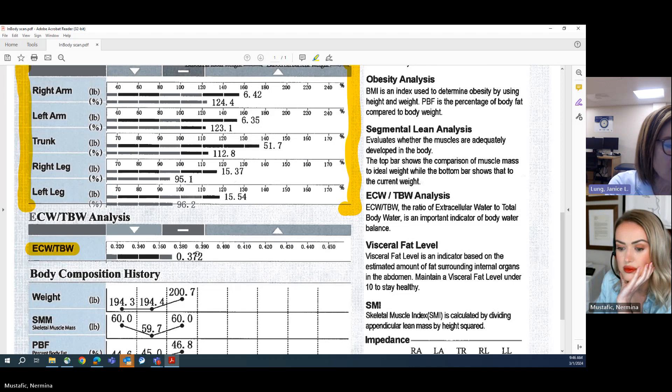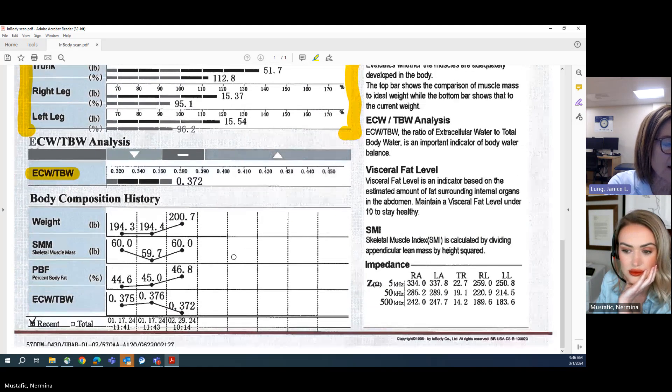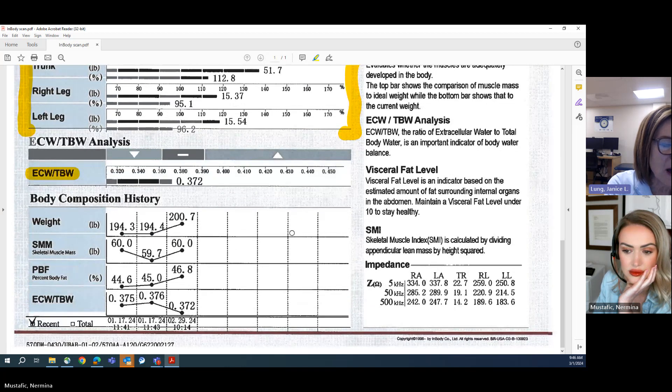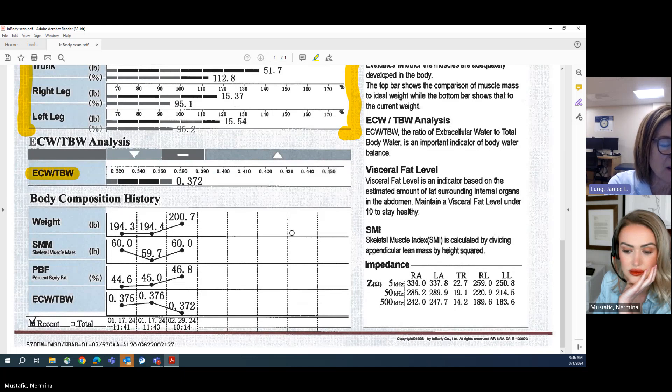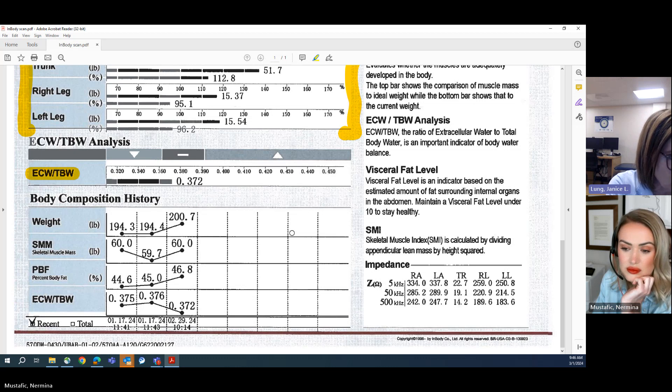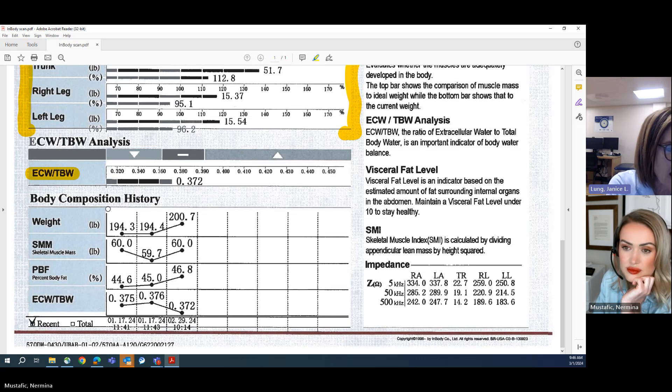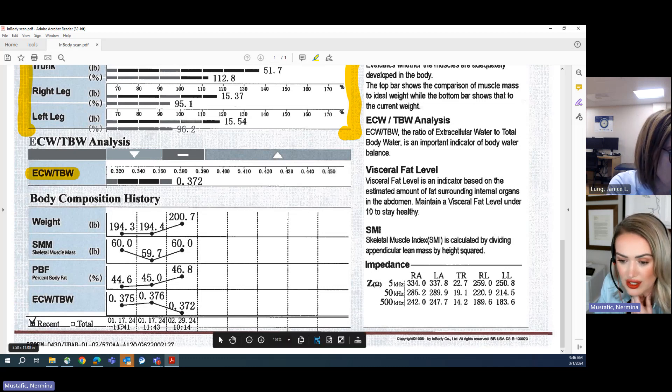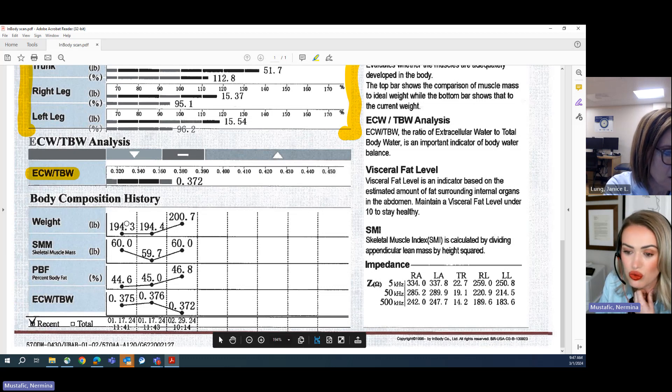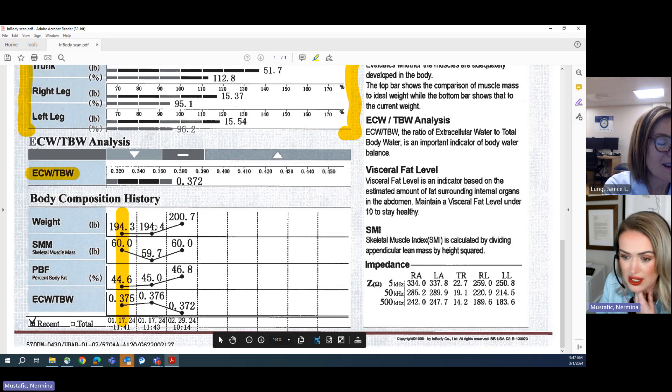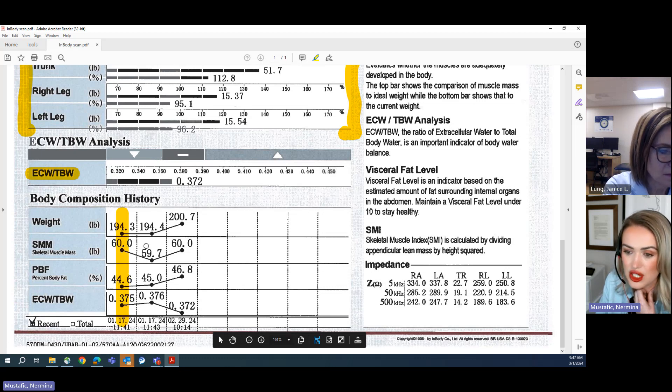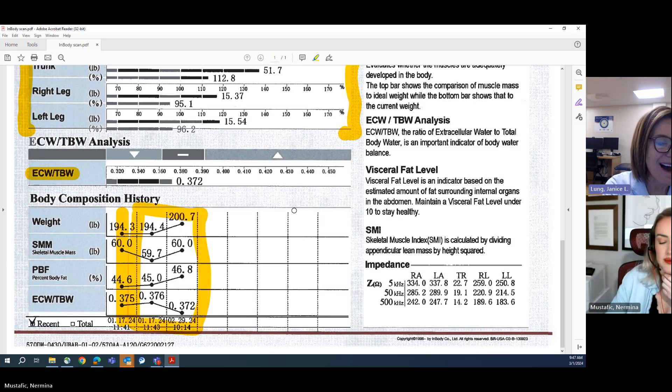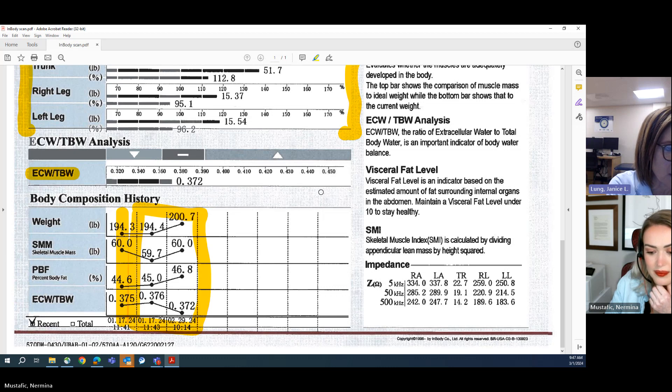If we go down to this body composition history, right away we can see that this particular person, she's done the InBody three times because she has three points here of interest. What we can see from this is that over time, ever since she took her first InBody January 17th of 2024, she's gained weight. Hold on, on this one, on that first on January 17th, that was the first time she did it, but we entered the information wrong. So this first column we do not count, but this second one right next to it, like two minutes later, is what we're looking at. So this right here. Spot on. Absolutely. Isn't that awesome.